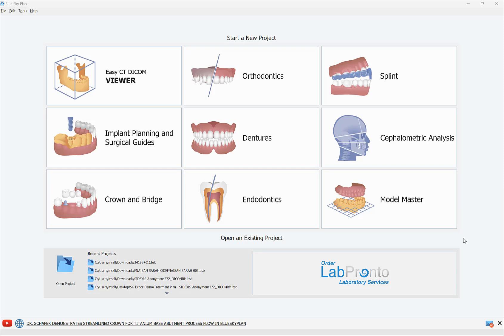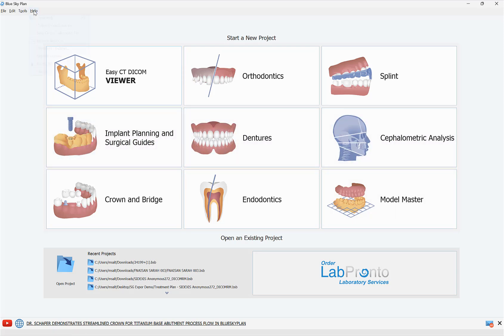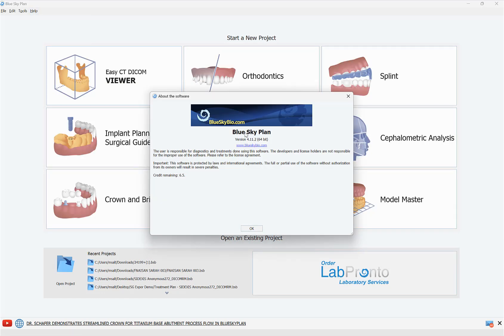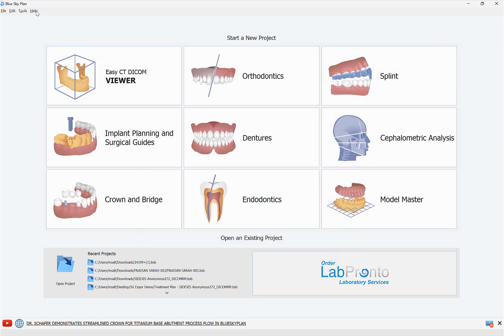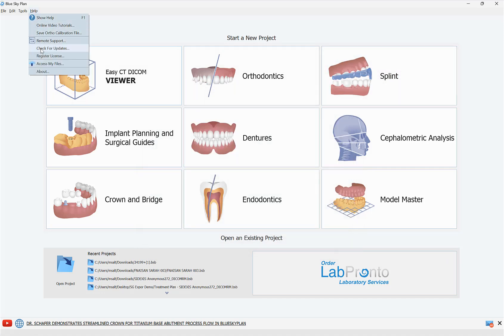We're going to start the process flow by clicking on Implant and Surgical Guides. Before I jump in, let me demonstrate — I'm on version 4.11.2 of the Blue Sky Plan software. If you have anything older, you should go to our website and download, or you could go to Help and check for updates.